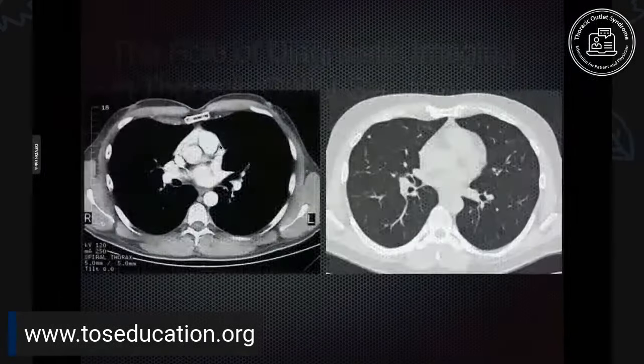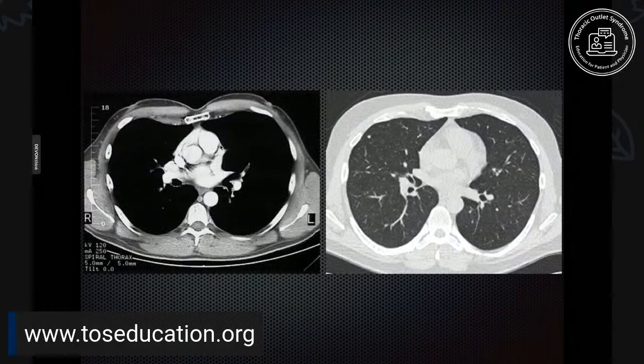Everybody's heard the expression CAT scan. These are slices through a CAT scan at about the same level in a patient. It's kind of like taking a knife and slicing through your body like a loaf of bread and making slices like this.